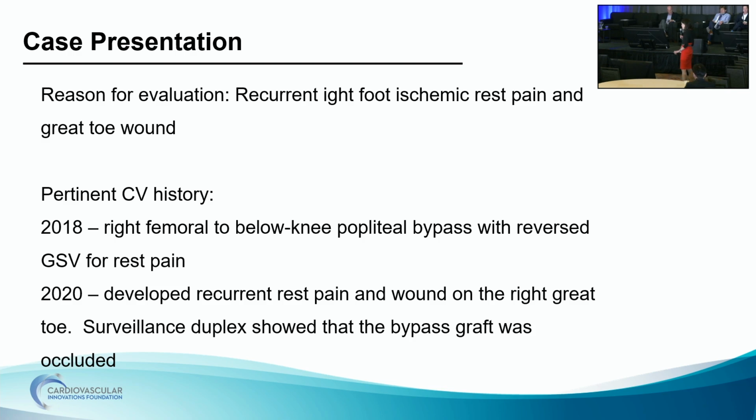Yeah, so to answer your third question first, because I remember it, we actually do surveillance for our bypass and our SFA stents. So we surveil them a little bit differently, a little less frequently than the bypass graft, but we still do surveillance duplex out to maybe 5 years now. For the first 2 years, it's about 3, 6, 12, 18, and 24 months, and then once a year out to 5 years.